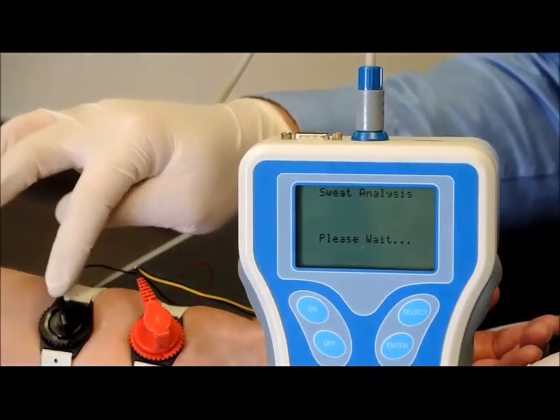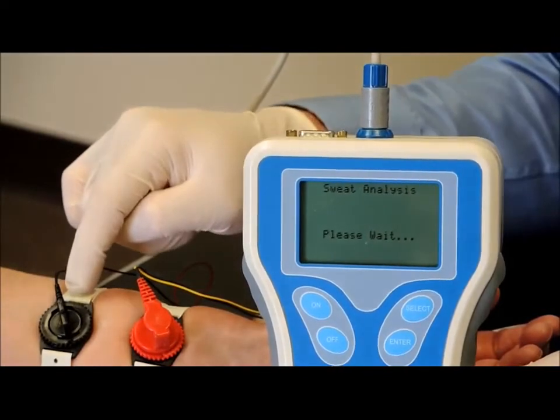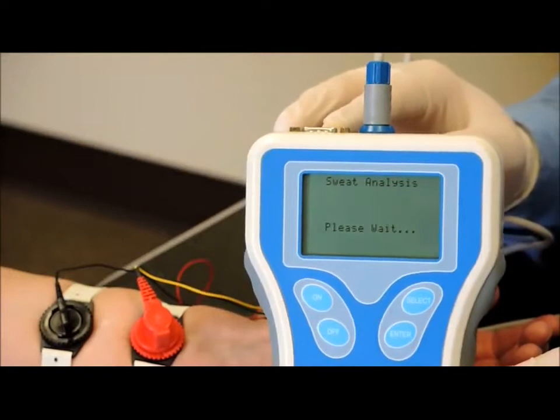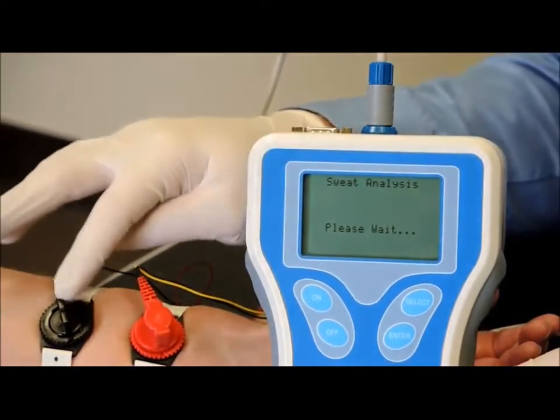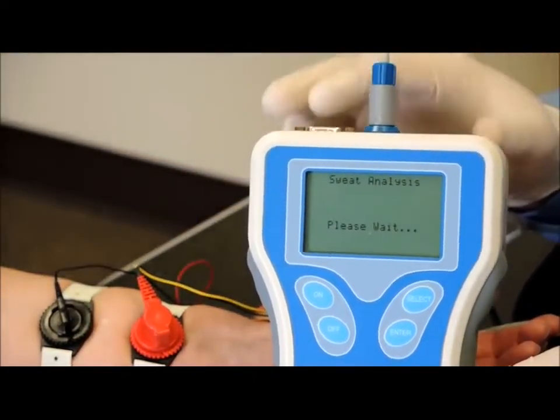Now keep in mind we left the black electrode on the skin. If we had removed that, we would not see that sweat at first electrode, and we would not see a sweating rate. And so that's very important to keep the black electrode on the skin so we can see those on the Nanoduct.